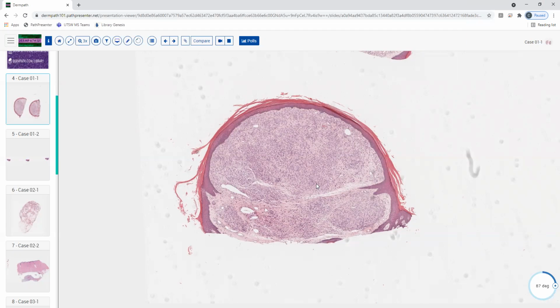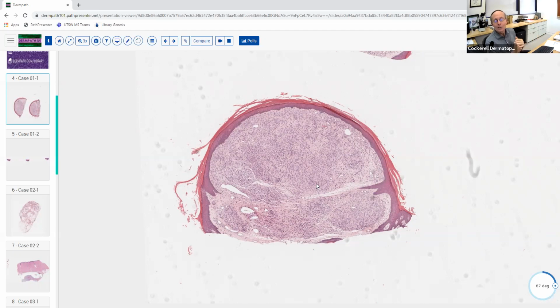I guess whether it's benign or malignant. Yeah, exactly. That's really the first question we ask once we decide it's a neoplasm: whether we think it's going to be benign or malignant. We're going to use other criteria, going to higher magnification to tell us that for sure. Sometimes we might even have to use genetic testing, but we're going to at least start off at low power. So if you think it's a neoplasm, do you think it's more likely to be benign or malignant, and why?